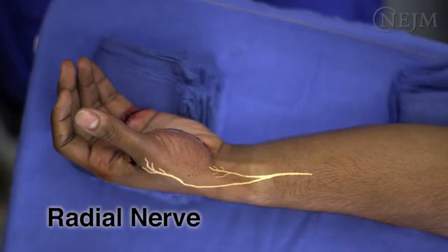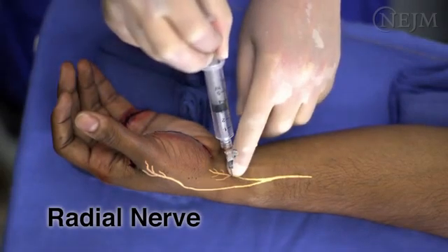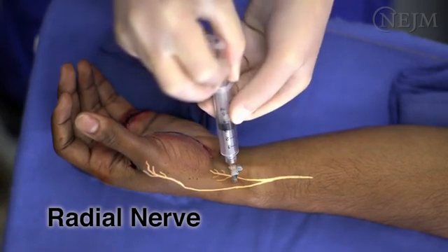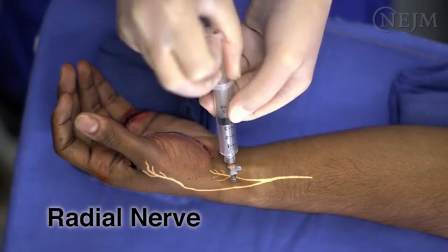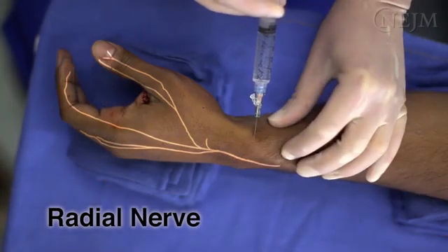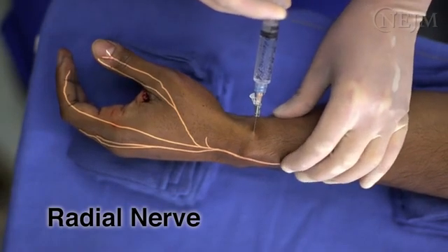To block the radial nerve, identify the radial artery and radial styloid through palpation. Insert a 25 or 27 gauge safety needle at the level of the radial styloid, directly lateral to the radial artery. Inject 3 cc's of local anesthetic. Subcutaneously inject an additional 5 cc's of local anesthetic along the dorsum of the wrist until you reach the dorsal midline.